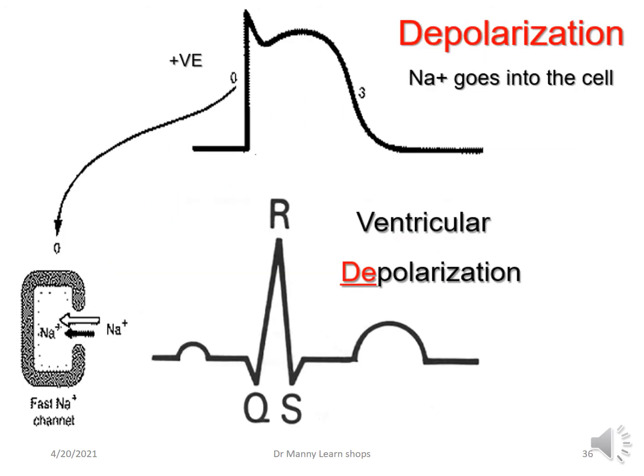And they're concepts that relate to depolarization, and what you're seeing in front of you is the action potential, simply, and the big ECG. Now, in order to get a big ECG, you need millions of these little action potentials. And they are all measured and they are combined on the big ECG. Measurement of small currents, galvanometer.